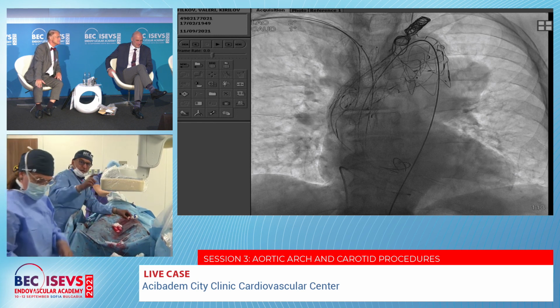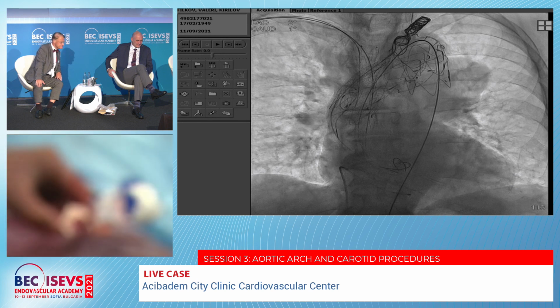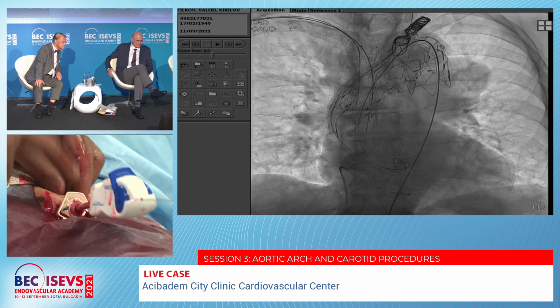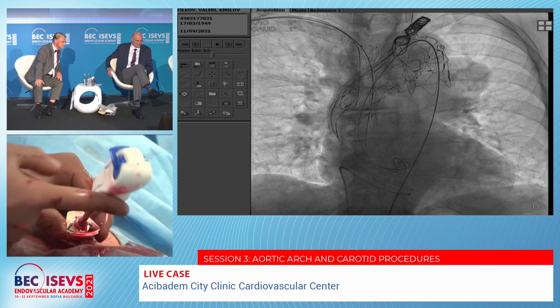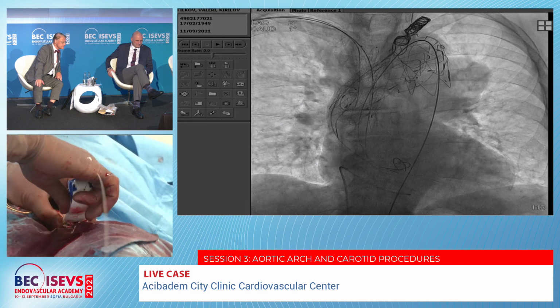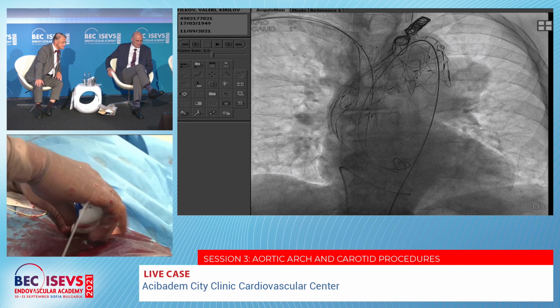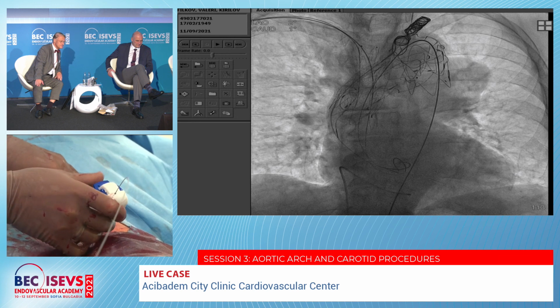Yes, okay. This is the Manta because it's, let's say, newer. Let's show the Manta. So the locator is already within the artery. And this is the plug. So now with a click, the anchor is already inside.